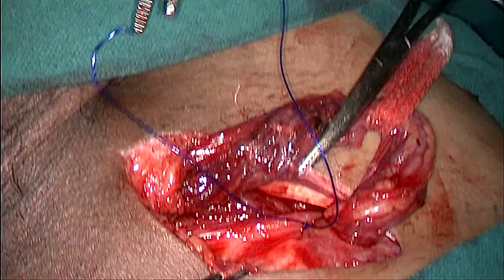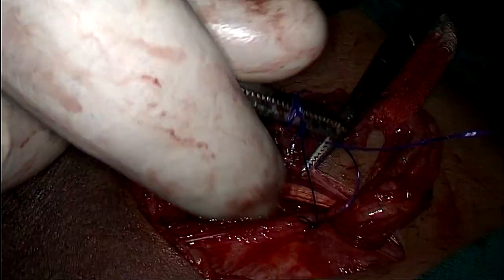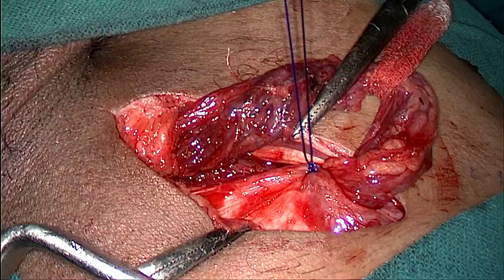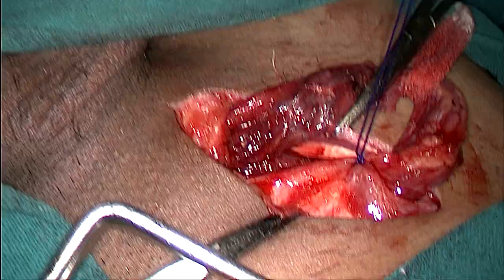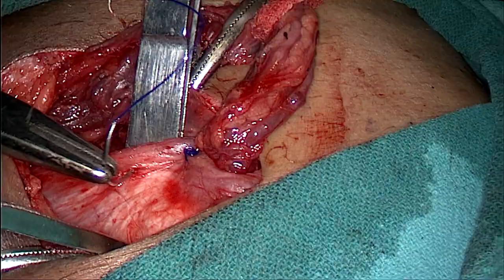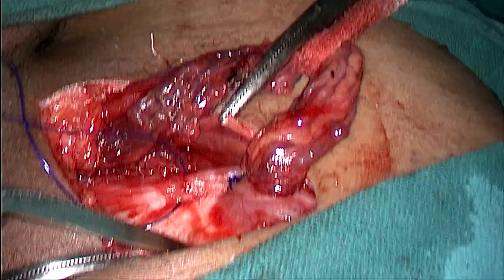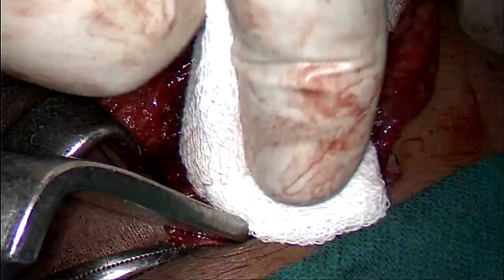You can easily appreciate the new deep inguinal ring from where the cord is arising. Now we'll continue the posterior wall repair in the same fashion. Try to avoid any bite on the external oblique aponeurosis to avoid any problem while fixing the mesh and closing the external oblique aponeurosis. Always remove the Langenbeck retractor before tying your suture.